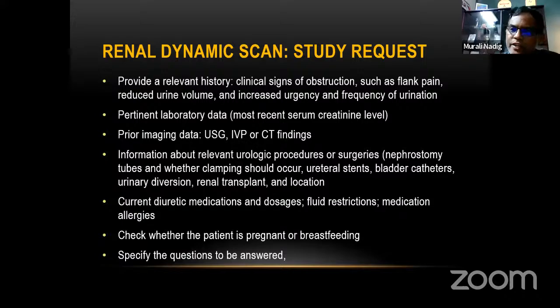In case of DTPA, if the creatinine becomes 2.5 and above, many times it becomes very difficult to see the kidneys itself. So calculating split function and so on becomes very difficult.